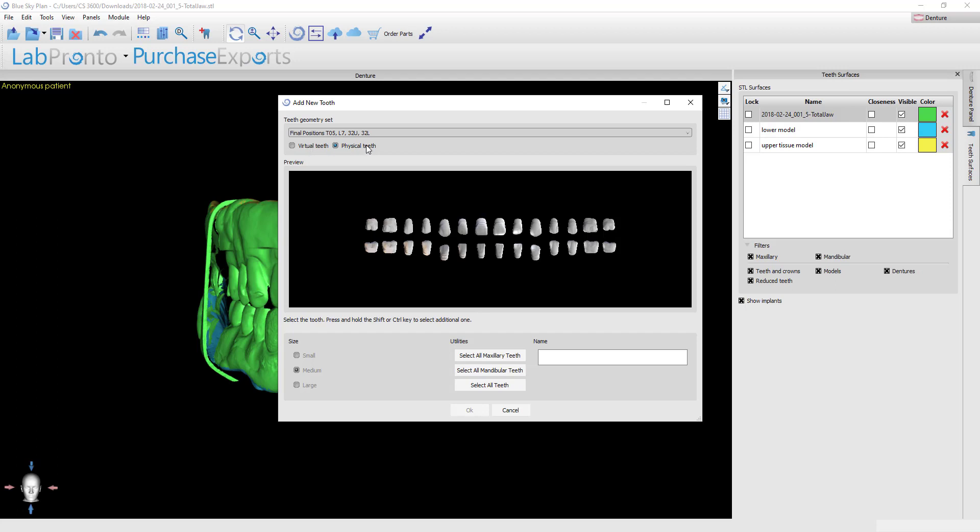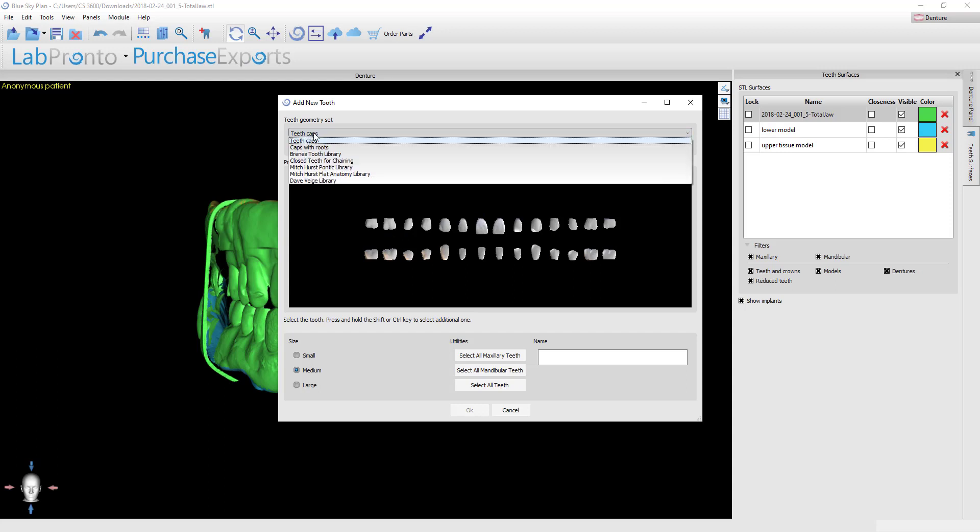If you're going to do this option, this would assume that you're probably going to mill or print a denture base just with sockets, but for the teeth you're going to actually grab those physical teeth from Nobilium and then bond them into the denture bases. If on the other hand you want to make a fully printed or milled denture, then you need to choose a virtual tooth set, and that's what I'm going to do here.